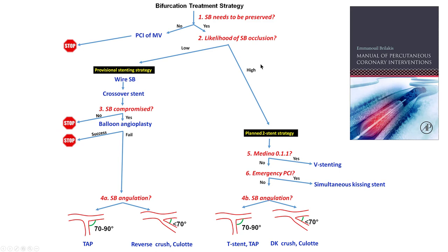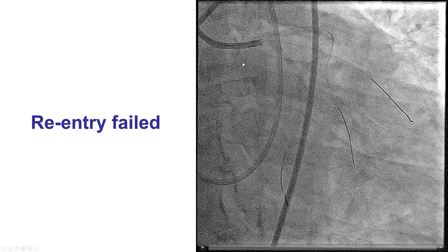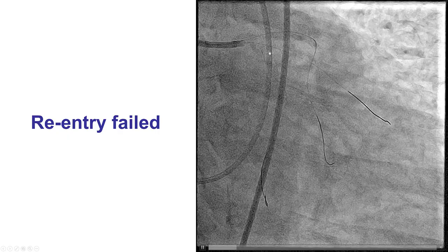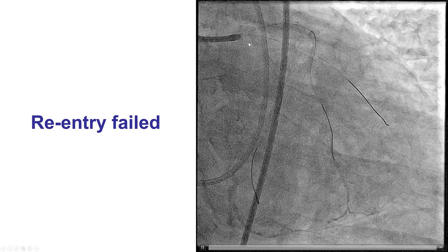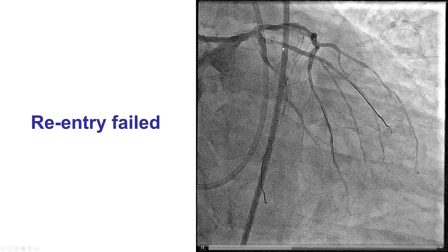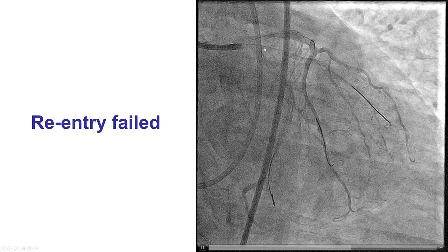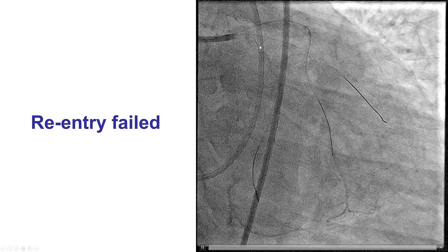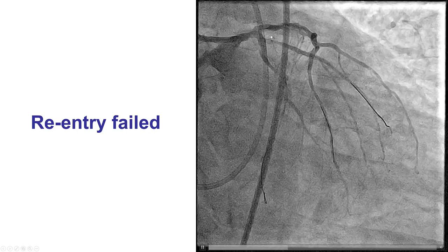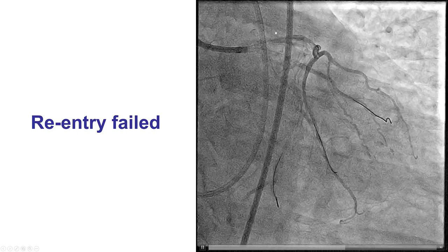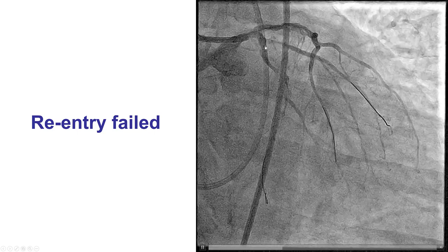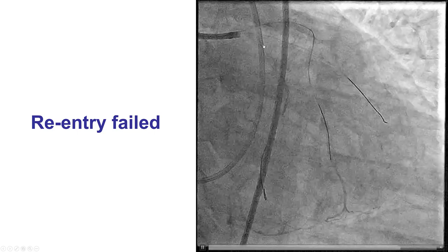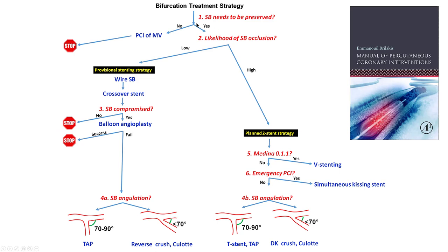We decided to treat the bifurcations. We have two adjacent bifurcations: the bifurcation of obtuse marginal one with the circumflex, and the distal left main bifurcation into the LAD and the circumflex, which are very close to each other.